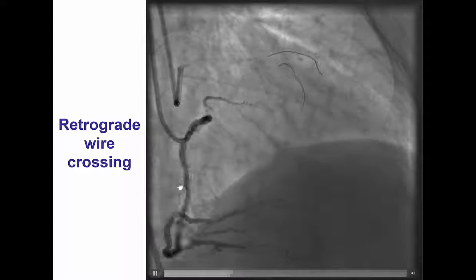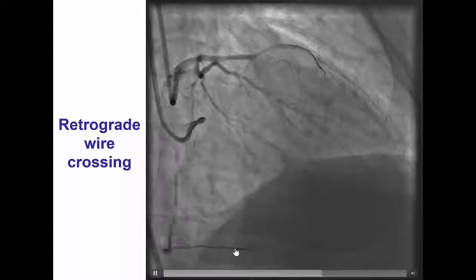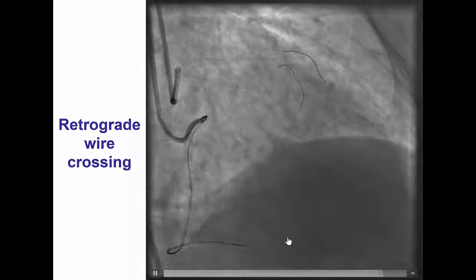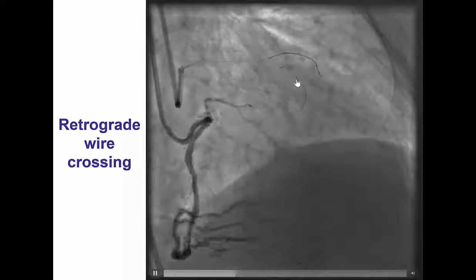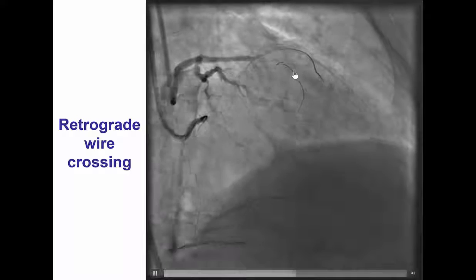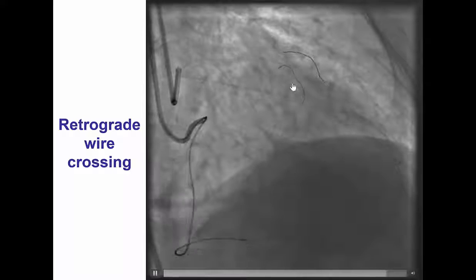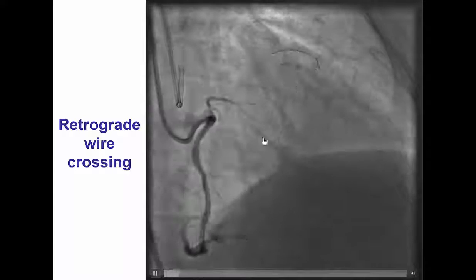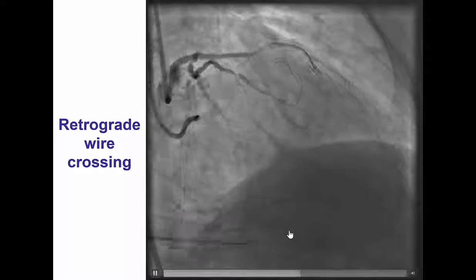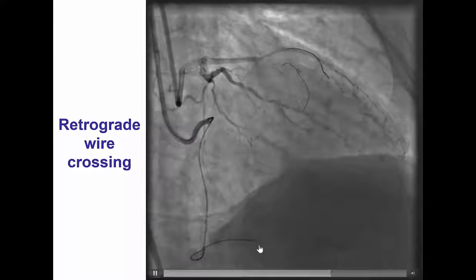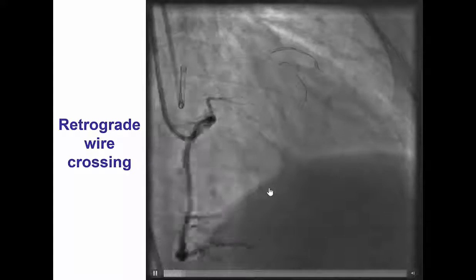We inserted a Corsair microcatheter to the PDA and then were able with the Fielder FC guide wire to advance all the way back to the mid-LAD, as shown by the injection of the right coronary artery. However, we then had the challenge that the retrograde Corsair would not advance past the distal part of the collateral.